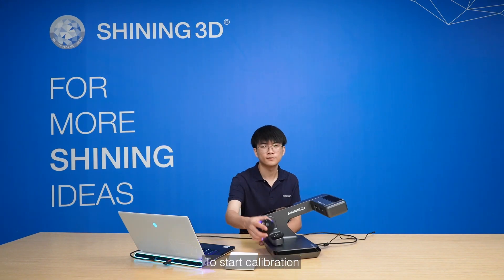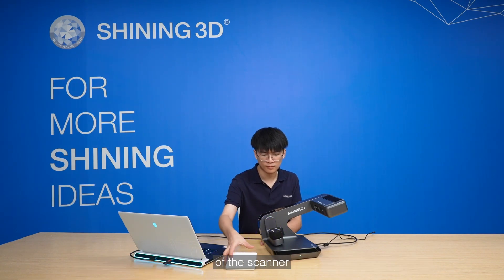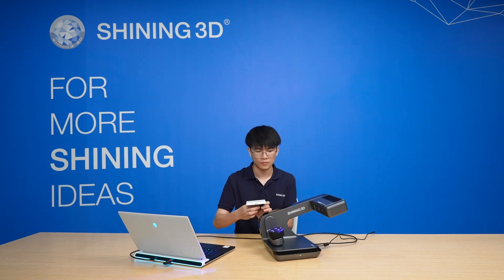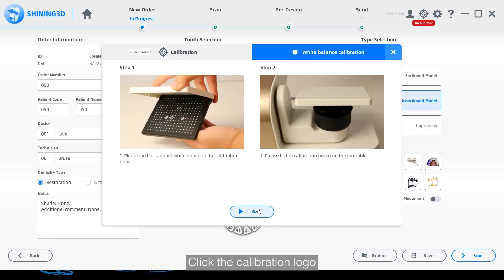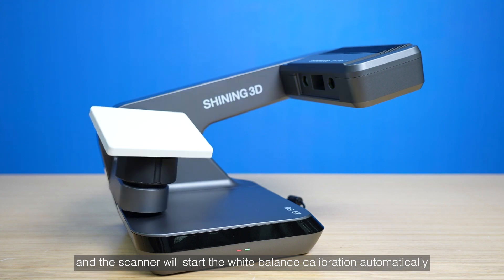To start calibration, place the height adapter and the white plate attached to the calibration plate on the turntable of the scanner. Click the calibration logo, and the scanner will start the white balance calibration automatically.